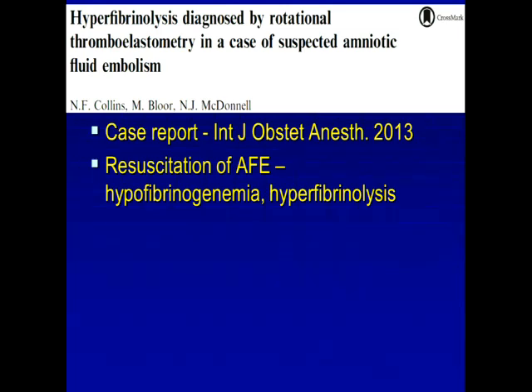There are some novel uses for ROTEM in obstetrics. So there are case reports where they've got a patient with an undiagnosed coagulopathy, and the question is, can they safely undergo a neuraxial technique? And in many cases, a lot of people would have just opted for a GA just to play it safe. But there are some authors out there doing ROTEMs on these patients and then doing a neuraxial if it's normal. That isn't a validated use of ROTEM, so it's important to keep in mind the limitations.